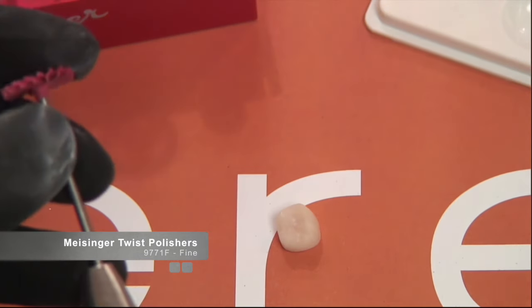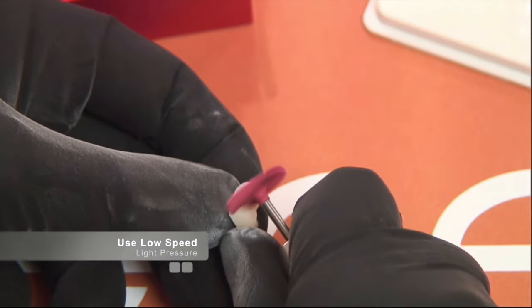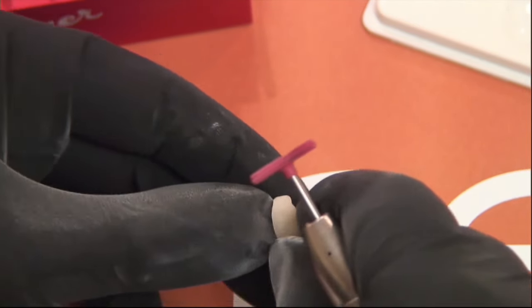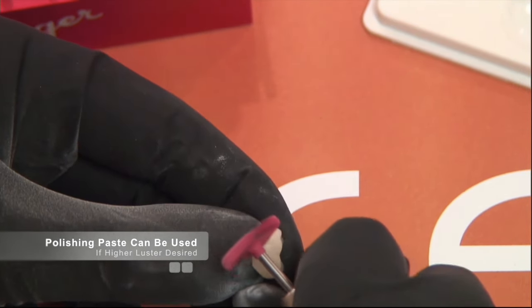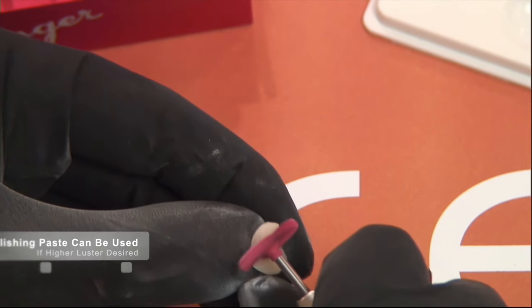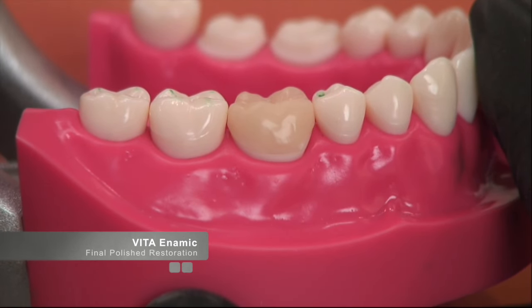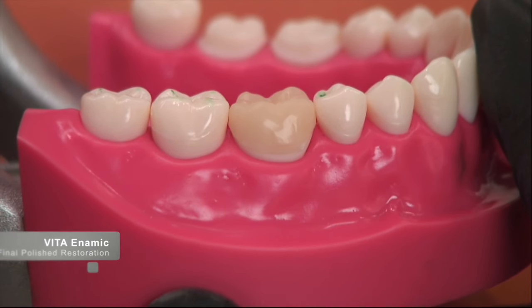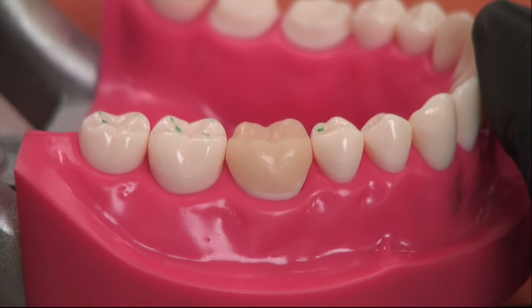Just because it goes faster doesn't mean it polishes any better. The final step is to use the high shine. Once the high shine is complete, you'll get a very nice surface on the restoration. This demonstrates how easy it is to polish this material. If you need a higher shine than what these polishers achieve, by all means use a polishing paste. As you can see from this short demonstration, we've managed to get a very nice polish on our Enamic block.